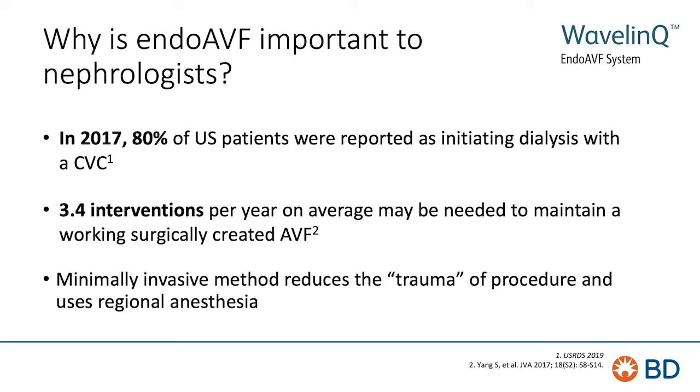I think they appreciate the fact that there is a minimally invasive option, that they can tell the patient that your surgeon is going to discuss this with you. Now, on the flip side, these are moderate flow fistulas, and the cannulation requires a new level of effort and focus in the dialysis center.